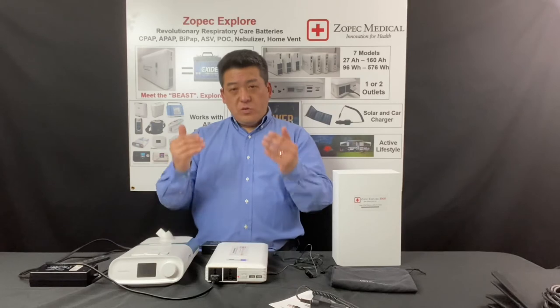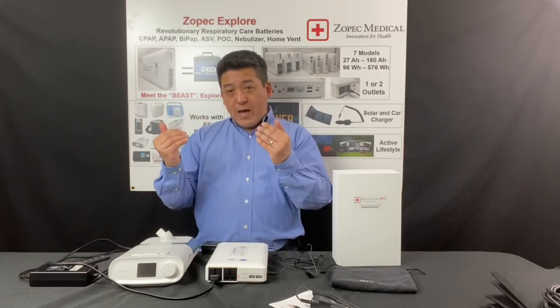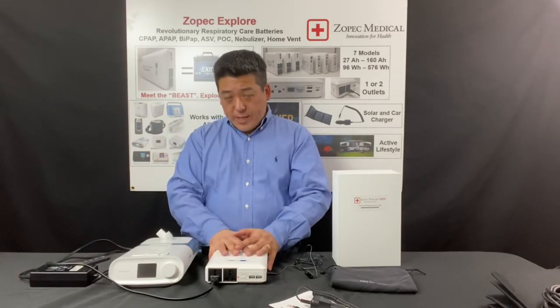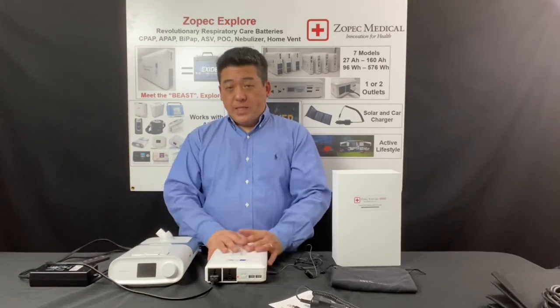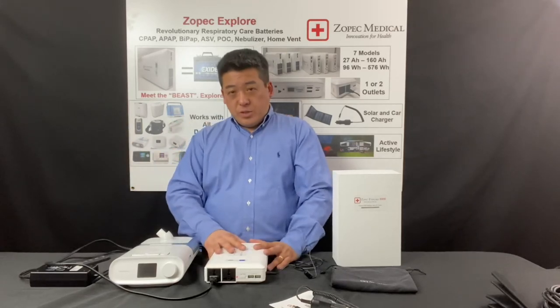If you start seeing the battery drain a little bit, you want to turn down your humidifier setting until it stays at 100%. If you want to run more humidity, you'll have to upgrade to the Explore Oxygen.